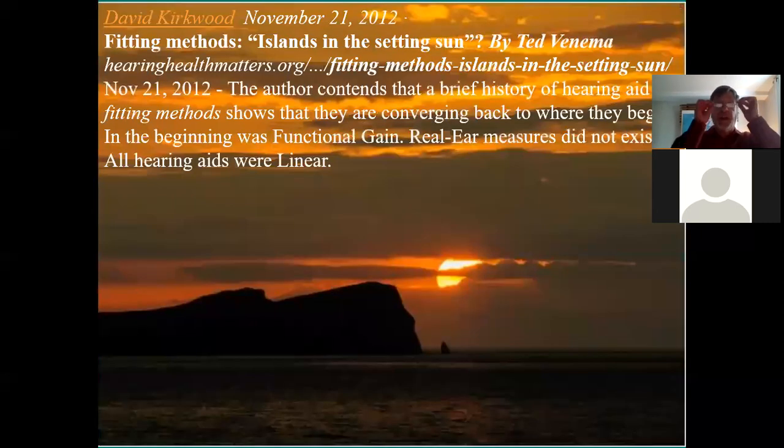So here's what I kind of wrote some time ago in 2012. Fitting methods are becoming like islands in the setting sun because of today's real ear settings. We can see what the person hears. Liebarger would have given his eye teeth to have our real ear with speech mapping. Because really, and I tried to be biblical here, they're converging to where they began.